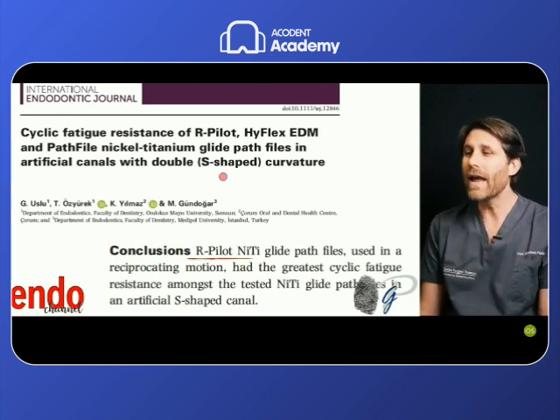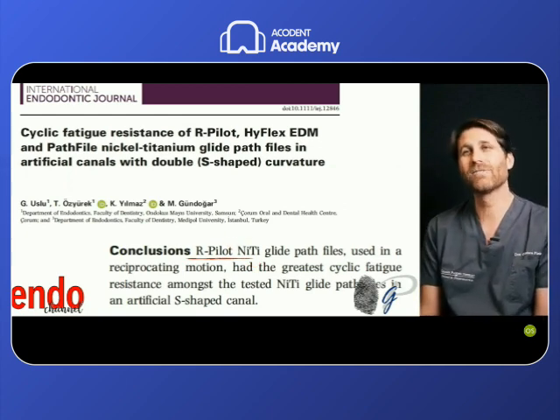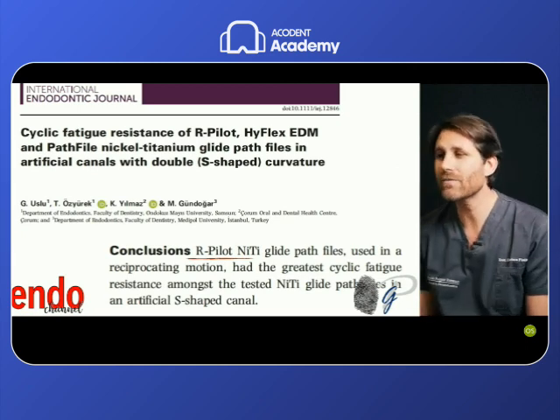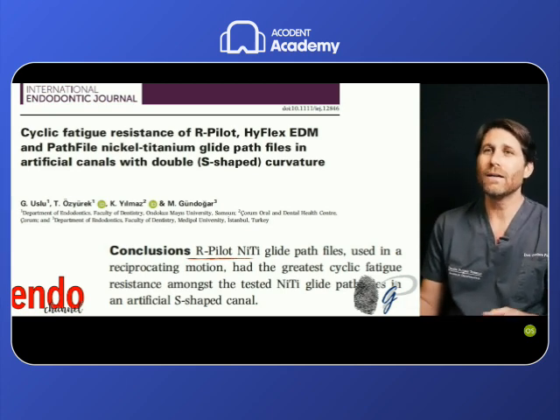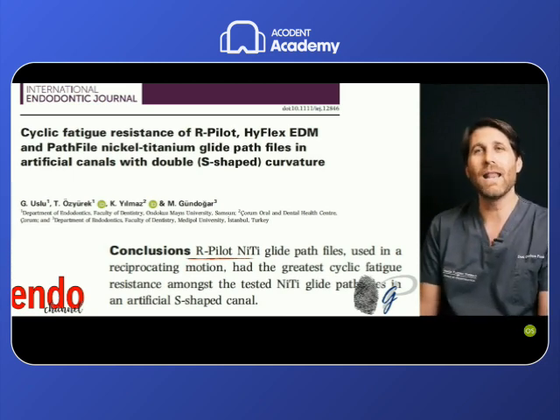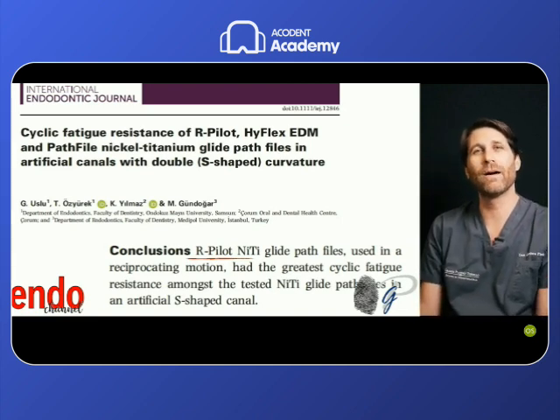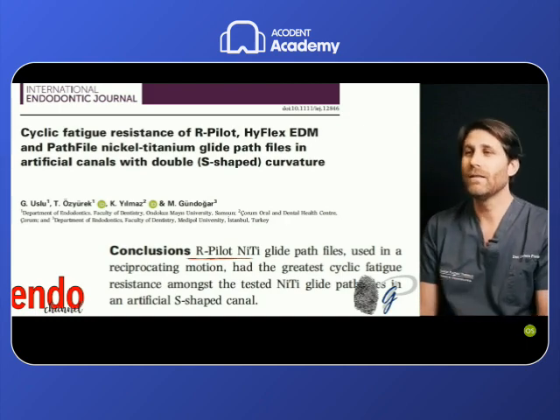So in this case, even if we have a less strong thermal treatment like the M-wire, the cyclic fatigue resistance was greater. That means that the design plays a role and increases the fatigue resistance of this file, despite the metal treatment being less prone to create a flexible file. So this design is, for me, the best design for a file for doing this.